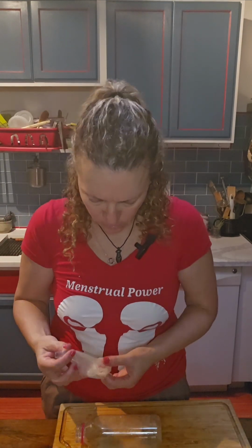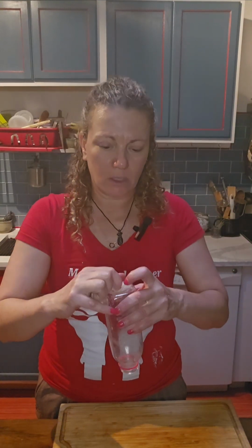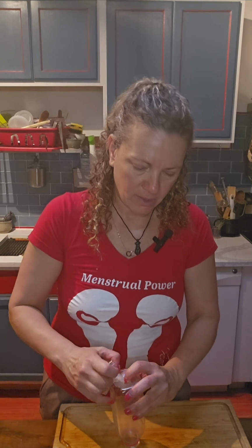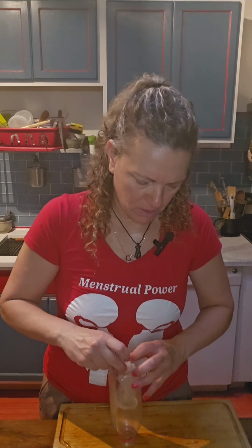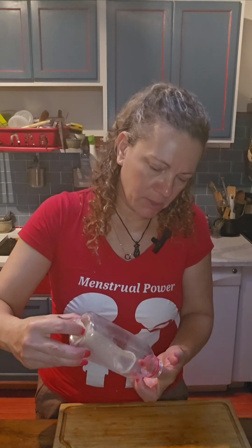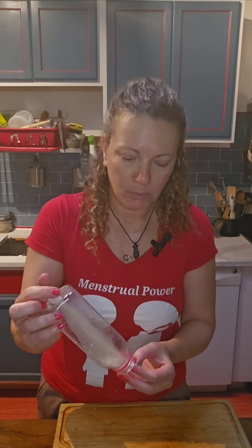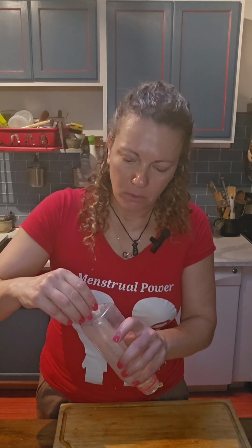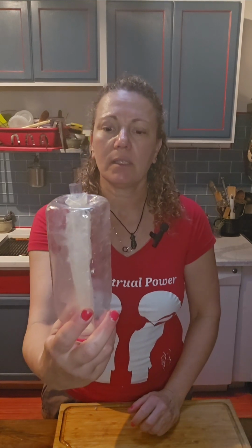Okay, so it went through. The condom is through the hole. And the most important thing about this part is that the condom should not be torn, because we're going to run fluid along this later on, and we don't want the fluid to go out. Okay, so this is it.